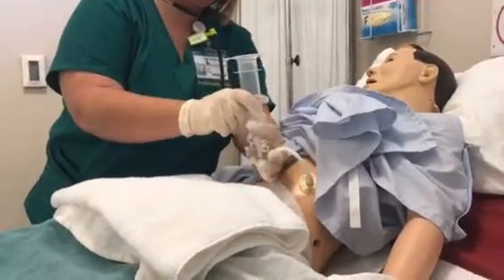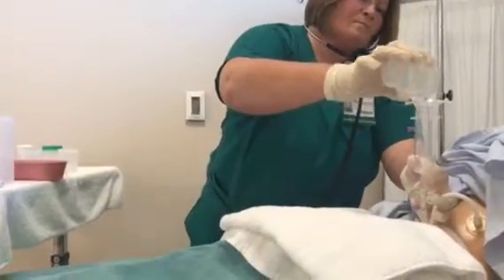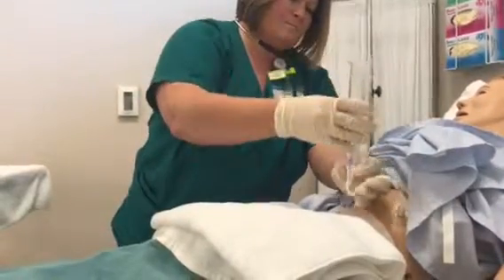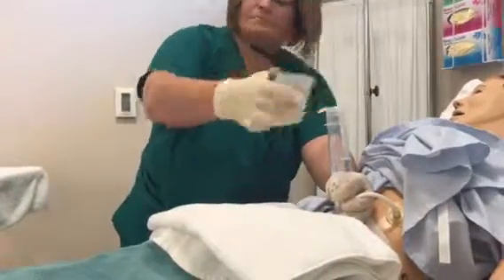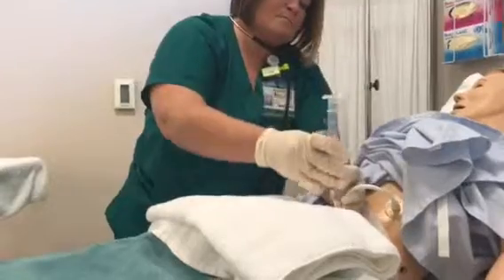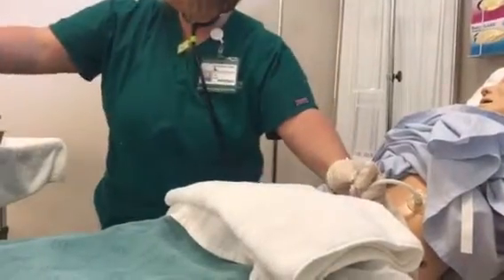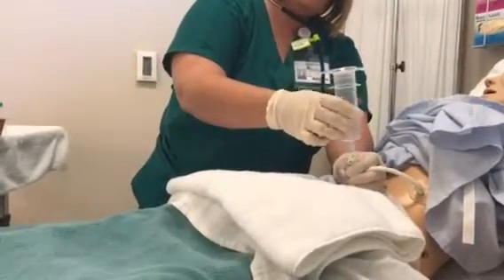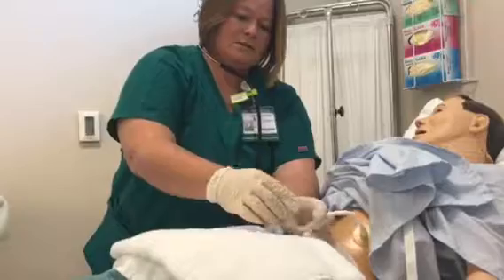So the first thing I want to do is I'm going to flush this with 10 mLs of water, okay? And now we're going to put in our nutrition. And we're going to flush that tube again, okay? Good. You always want to make sure too, if you're not administering enteral nutrition, that you have the proximal end of this tube clamped at all times.